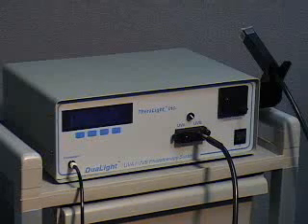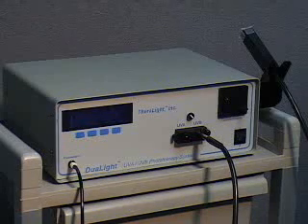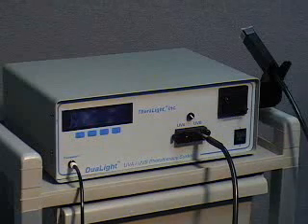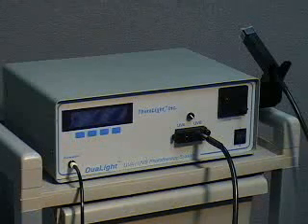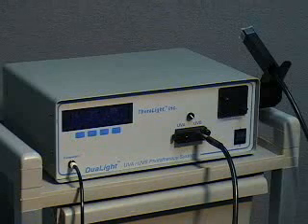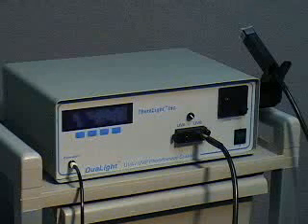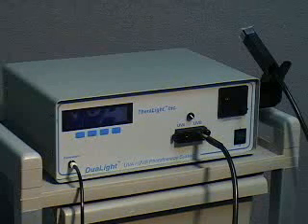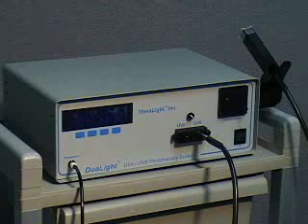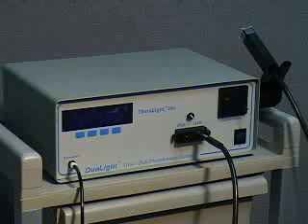A frequent question is: how do you determine what the initial dose of UV-B should be? The answer involves photo testing. Photo testing is a procedure used to determine how sensitive a patient's skin is to UV-B. It is quick and easy to perform. First, isolate an area of normal skin with little history of exposure to UV radiation. Frequently, this skin area is located on the lower back, upper abdomen, or buttock area.